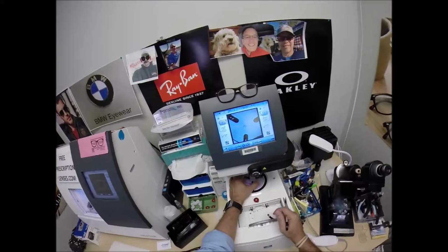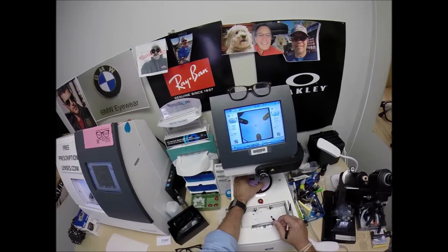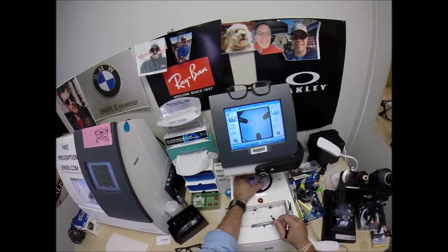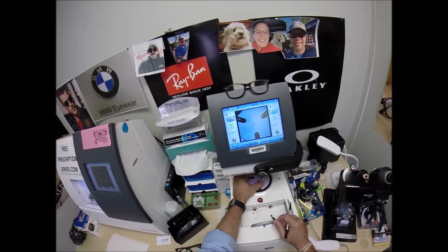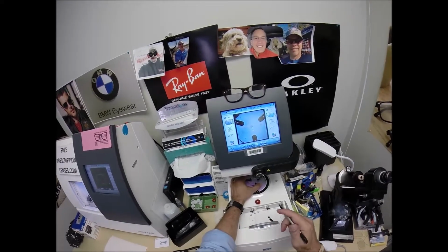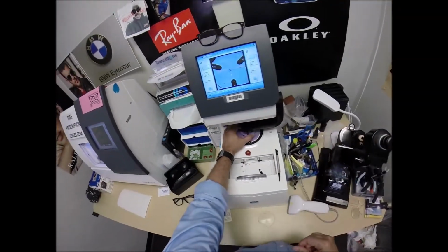A little speck. It's messing with me. Get everything lined up where it is supposed to be. Come on now, come on. I get little yellow dots, confirmation when they're in the right place. Okay, hit that button. The arm's going to come down, place the block onto the right lens.